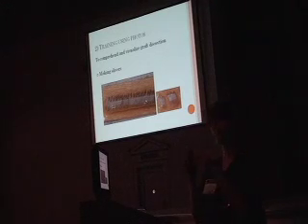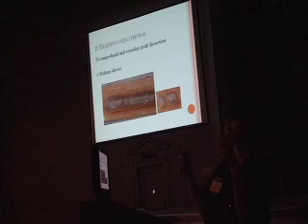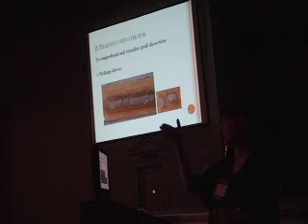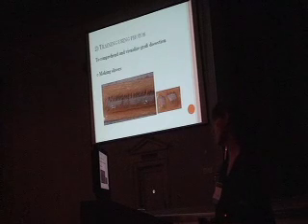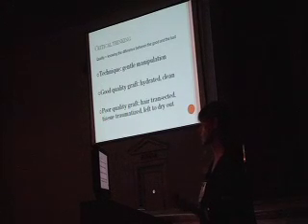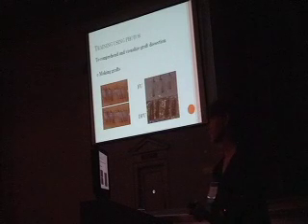And then I teach them that first, then I take a clean photograph without these lines, and I have them draw the line with a pen to imagine where they would cut, so they can start visualizing what needs to be separated and how. And on the right hand side are slivers, so they know what they're doing. And the next one would be graft dissection.